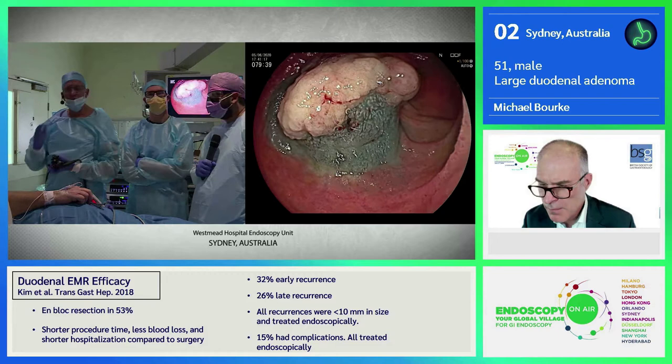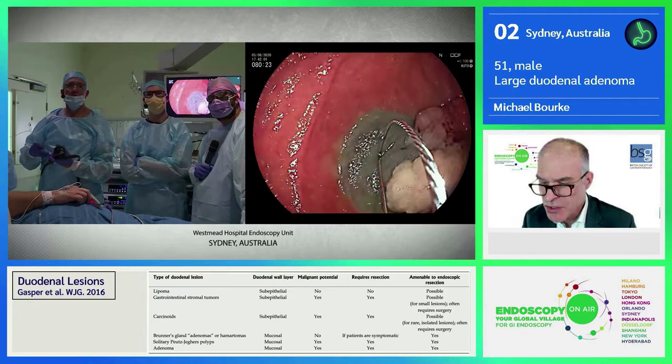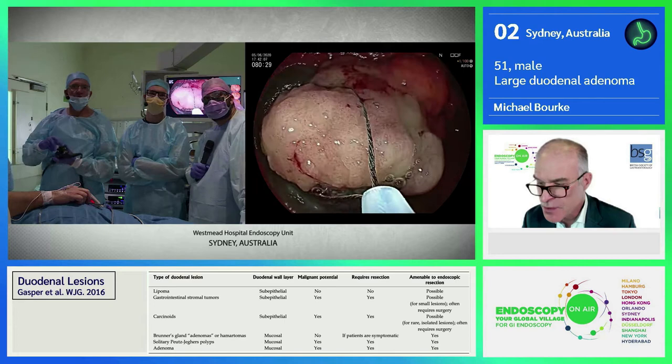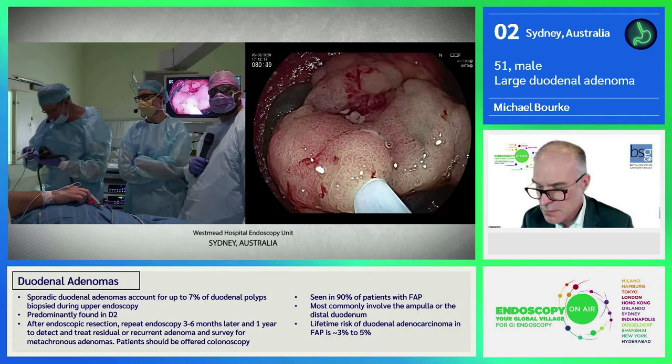Okay, so again, where to start? The other thing we used to see with hot snaring, particularly very large lesions, is you get a lot of duodenal deformity when you go back. And in FAP, of course, they do tend to get recurrent polyp. You've got a problem with access. Close. But less so with cold. Yeah, the lumen, it doesn't result in any luminal stenosis. Yeah. You see little scars, but nothing extensive.